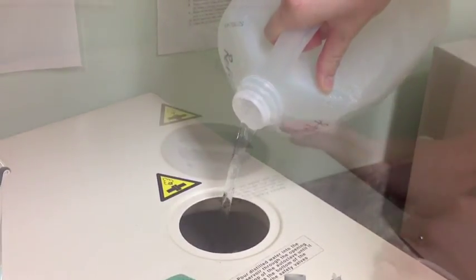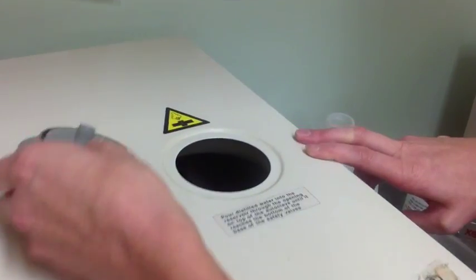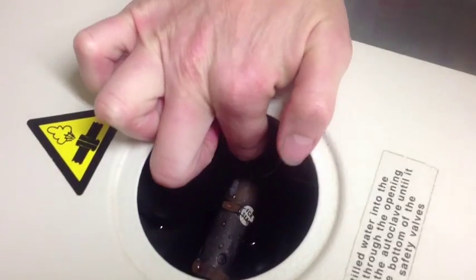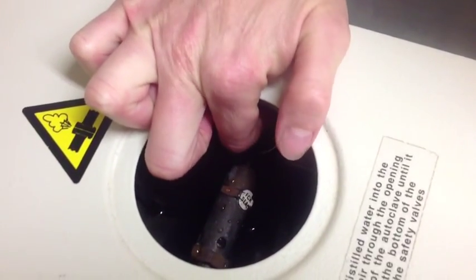Refill the reservoir with clean distilled water. And last but not least, clean the air trap jet by manipulating the air trap wire back and forth.